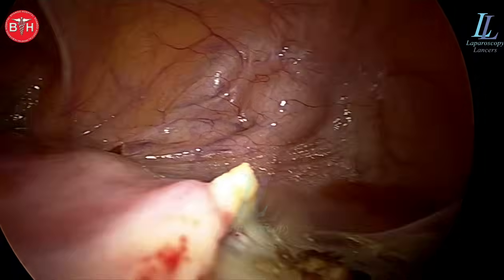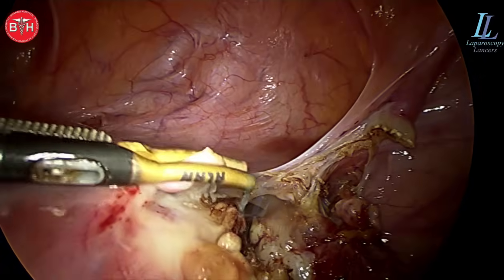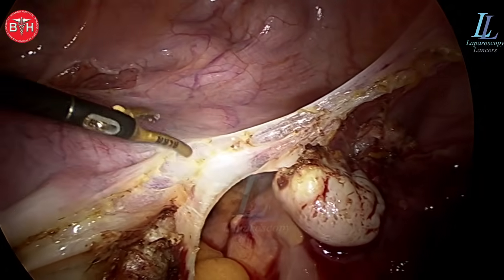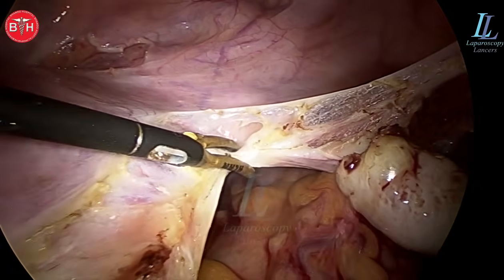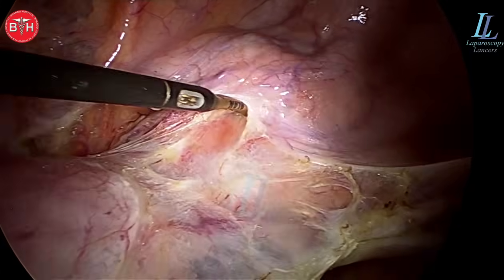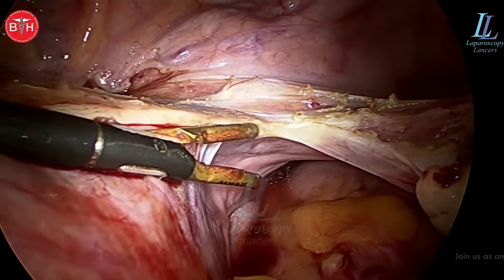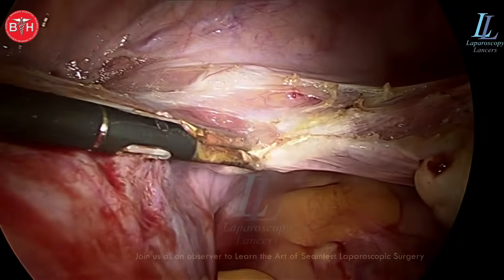Please do not do a laparotomy on a female for any pelvic pathology — everything can be dealt with laparoscopically, and deep pelvic surgeries are even better. You will not be sweating while removing the uterus. A laparoscopic hysterectomy for a DUB uterus doesn't take more than 20 minutes, and the patient recovery is in one day only. In open surgery the patient takes much longer, with ongoing pain and chances of incisional hernia formation.